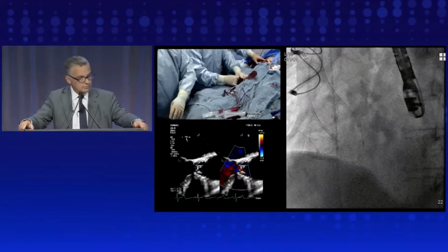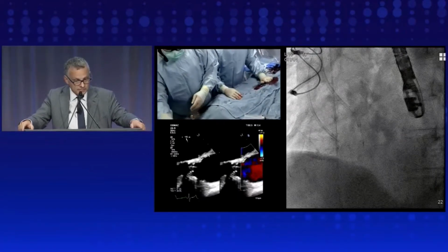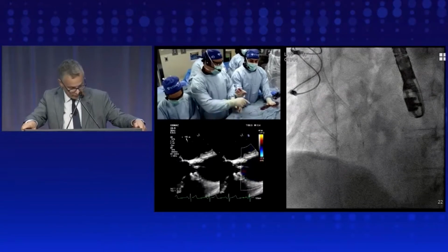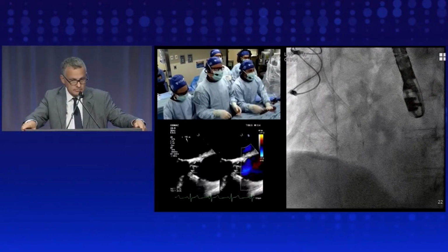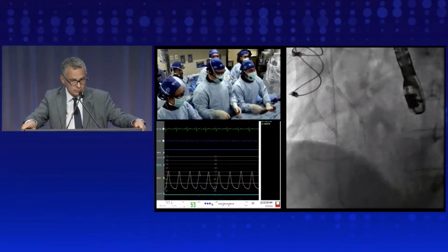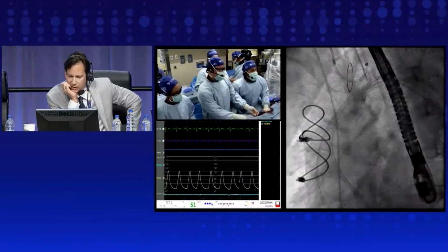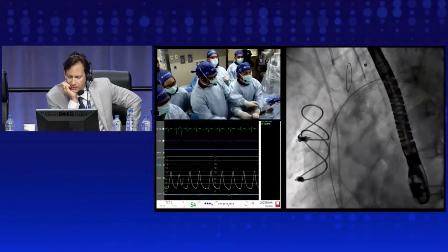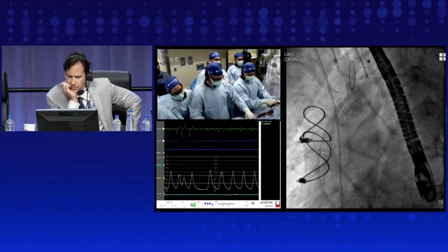Actually gives me opportunity to briefly talk about the fact that, yes, we have a question from, I think, Vasilis. Mark, can you show us the pressures? Yeah, sure. A lot of the time these patients have a low diastolic, and we started with a low diastolic. Her diastolics are in the 30s and 40s. They've been that way from the beginning.